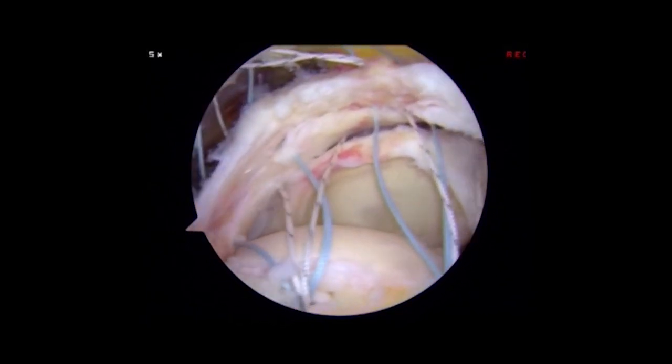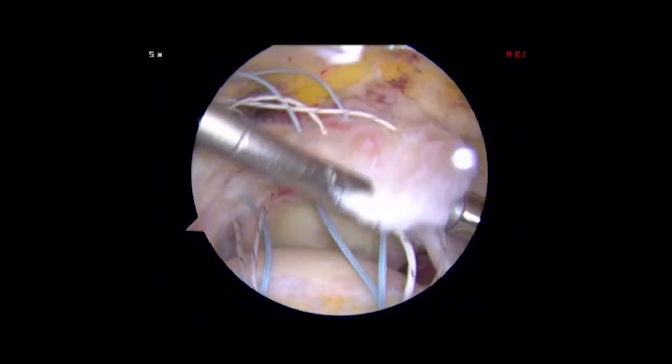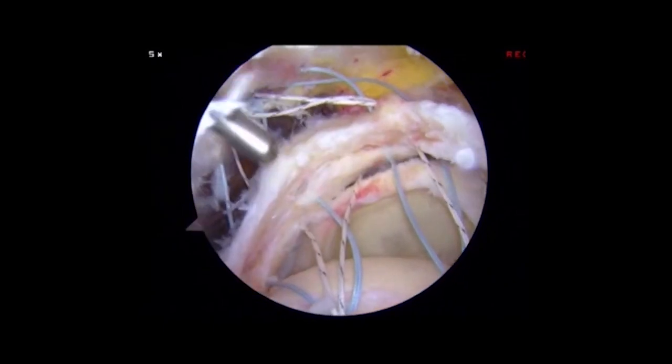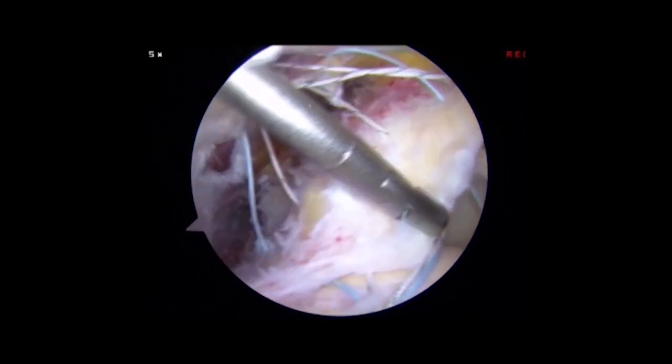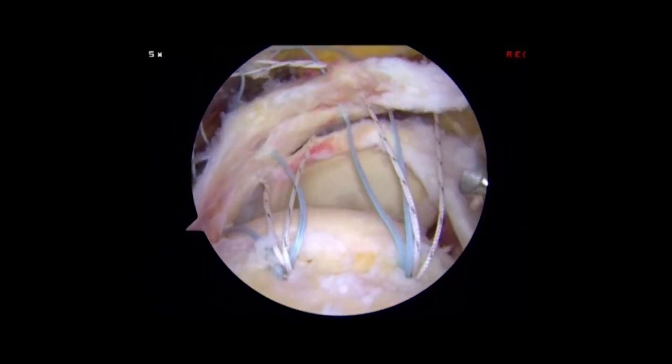Two double-loaded medial row anchors have been placed, and sutures are carefully passed at the appropriate position in the cuff so that when these sutures are tied, there's not an over-lateralization of the rotator cuff repair.